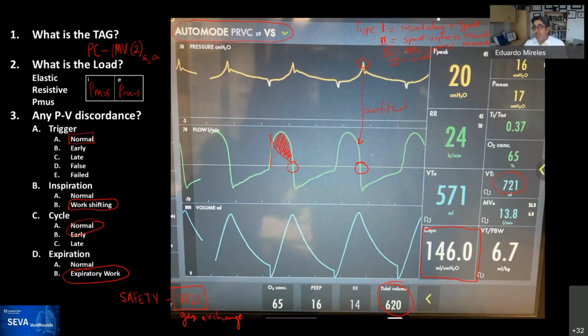That's a potential, as long as they don't generate very large diaphragmatic excursions and transpulmonary pressures on the P high. That would be a way to decrease the tidal excursion of the diaphragm, just going really high up, as long as they can stay synchronous with it.